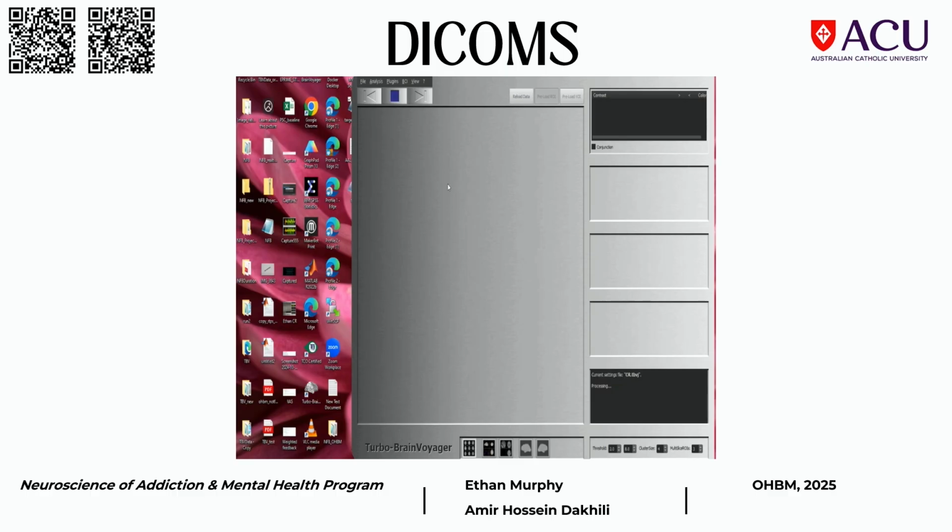So we ask Beck or whoever the radiographer is what the series number was, and that's the series number we input into TBV. Once you start the neurofeedback, every run is going to be 2 DICOMs after for us. So if you check your target folder and the last DICOM series number was 30, you have to go into TBV and set the expected one to 2 plus that, so it's going to be 32.